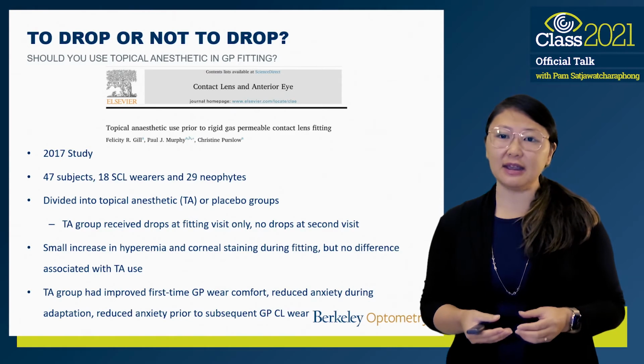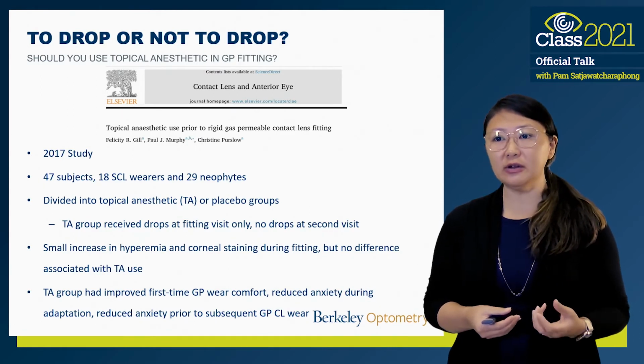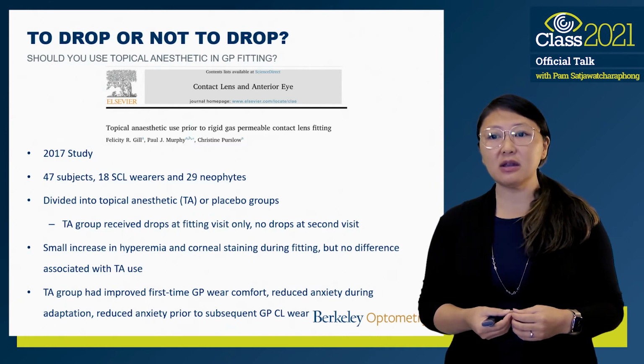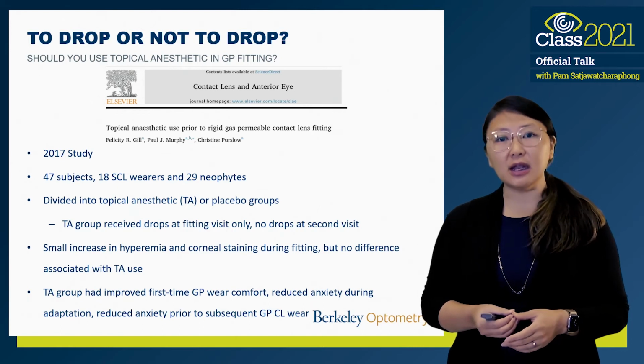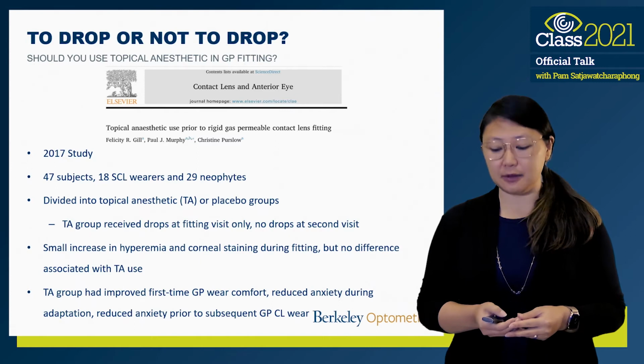What they did find, again, is that the anesthetic group had improved initial GP comfort, but they also reported reduced anxiety during adaptation and prior to subsequent GP wear later down the road. So again, some sort of lasting impact has occurred here using anesthetic.